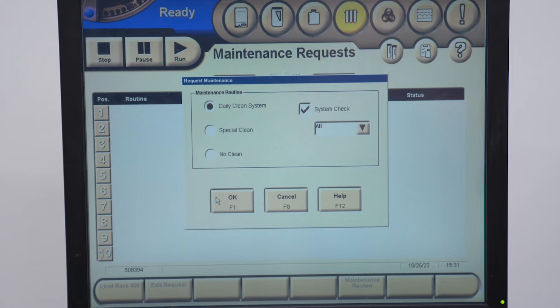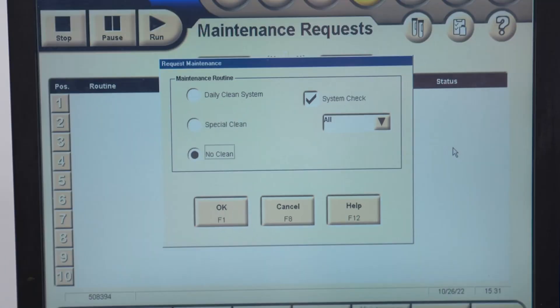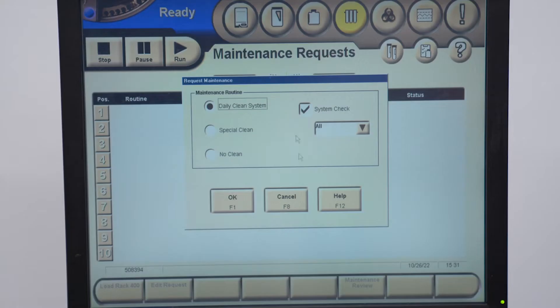You can also click Special Clean if you want a more thorough, deeper clean. There's also a no clean option — that's what my employees tell me when I ask them to clean stuff, they say no clean. Anyway, you can also check the System Check button too.